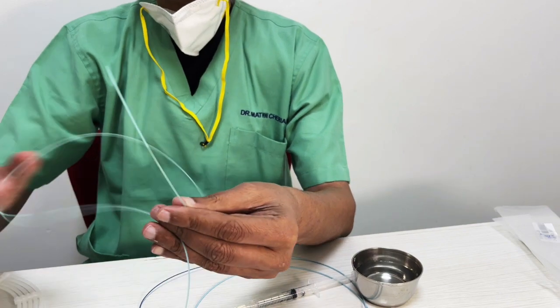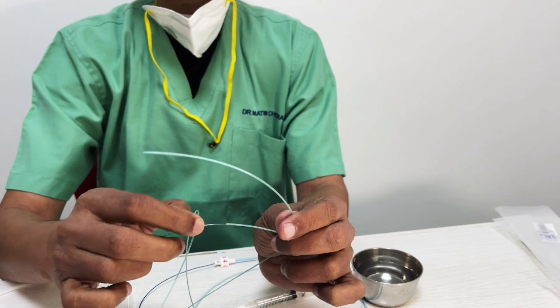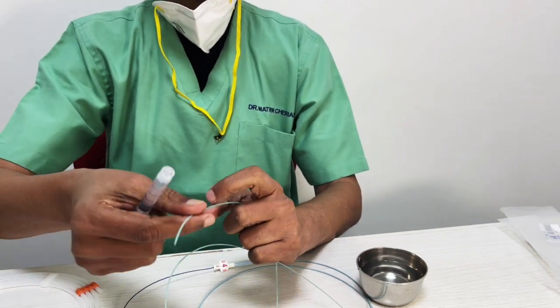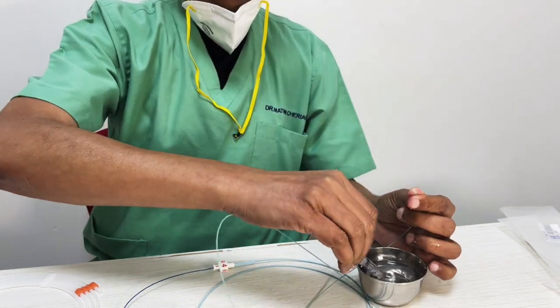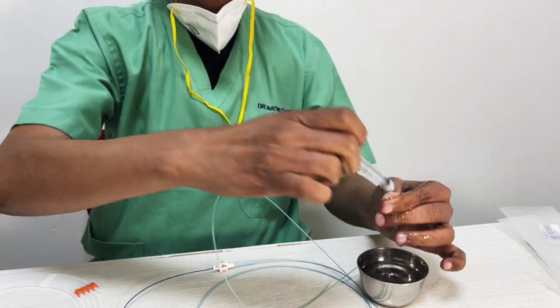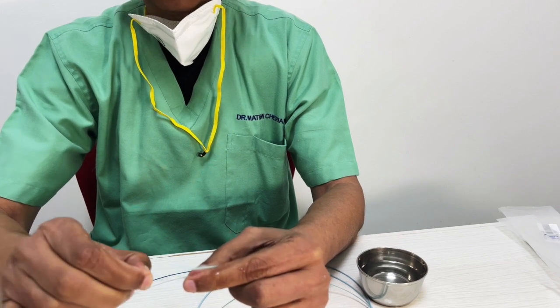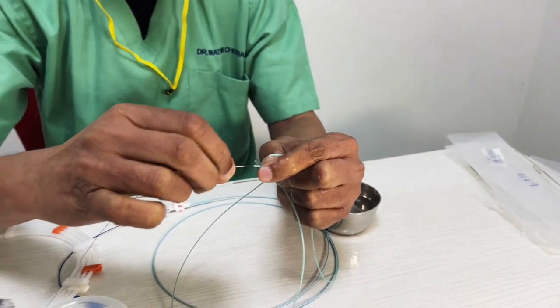So how do you push it out? If you have a Y connector, a single person can do it. You have fixed it tightly. There is, of course, infusion running. This is so tight because it does not have a flush. We try to wet it a bit and see if it's possible to move it out. In real life, there is an infusion that we're running. Okay, I think it's come out. Let's push it and see whether this coil comes out. It's sticky because these are repacked.